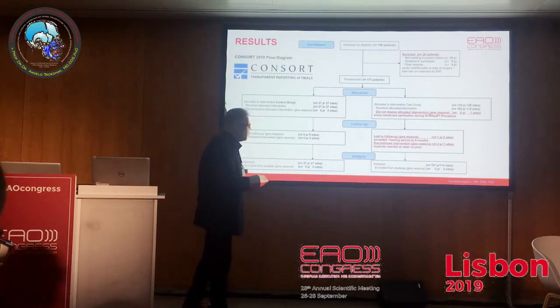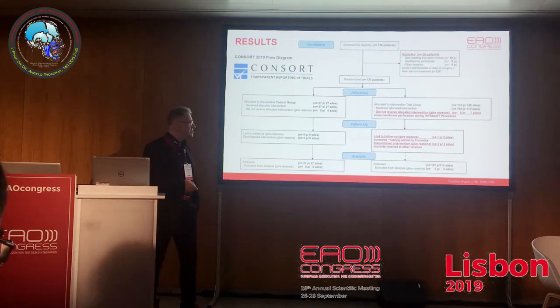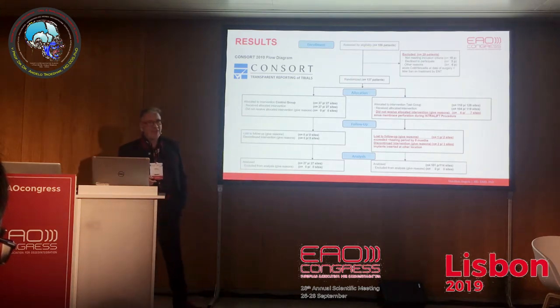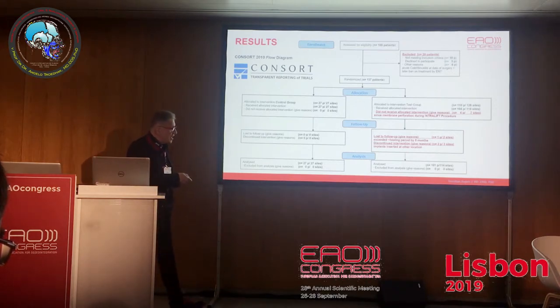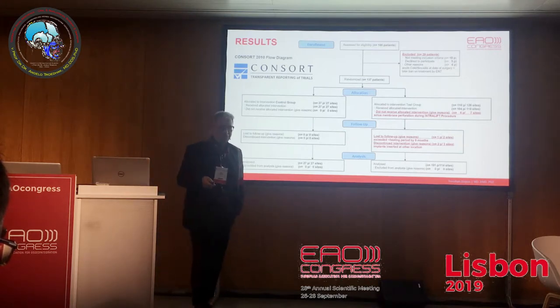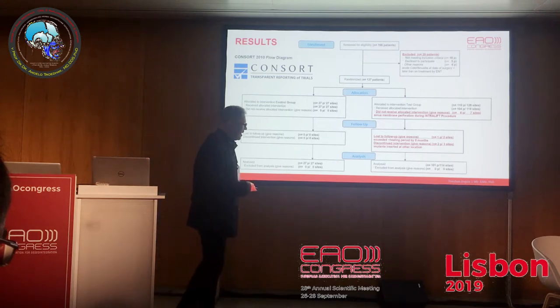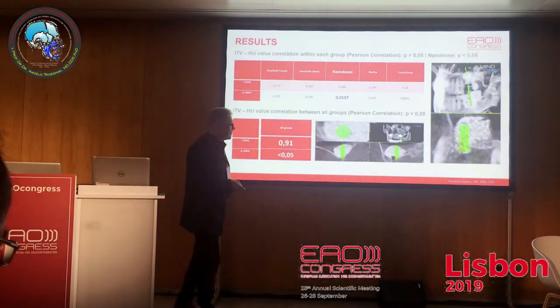In the follow-up period, we lost another patient with 2 sinus lift sites, because the patient showed up only 8 months after the healing period ended, so this would have also biased the results. And 2 patients with 3 sinus lift sites had their implants inserted at other locations because they were cheaper there, so we couldn't include them for the insertion torque measurement. So at the end, we analyzed 101 patients with 114 sites.